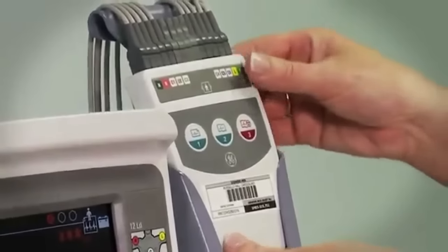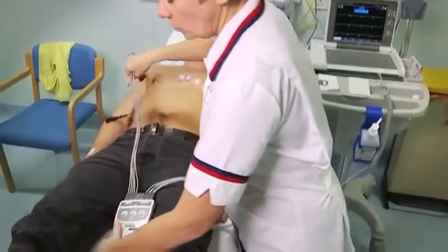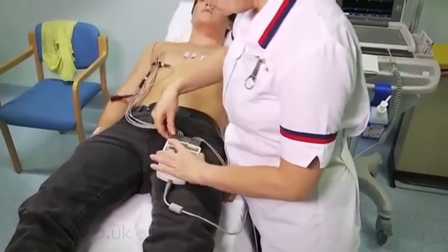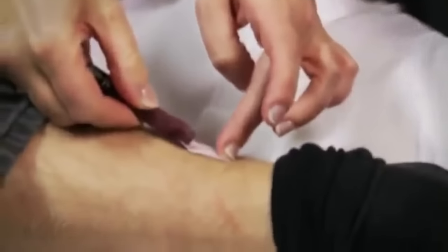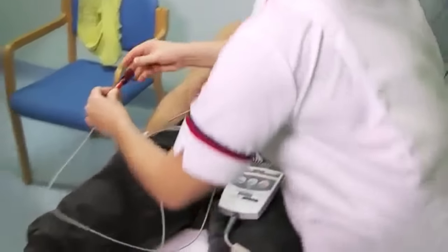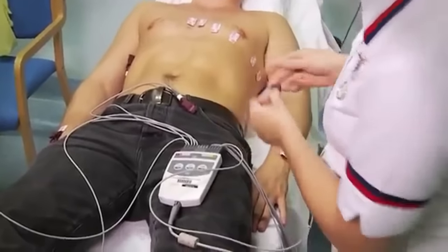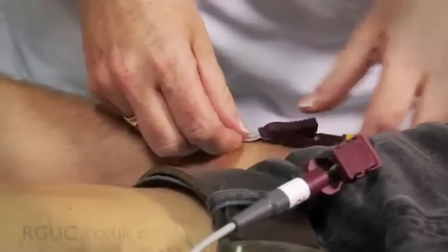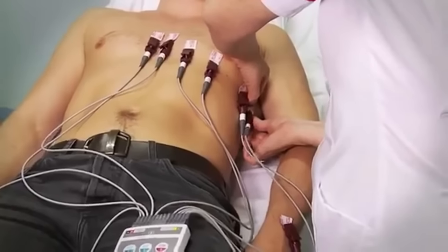Once the electrodes are in place, connect the lead clips to them. Ensure that the leads are correctly connected to the corresponding electrode tabs — the leads are clearly labelled to enable this. Attach the limb leads as follows: on the right lower leg, place the black lead; on the left lower leg, place the green lead; on the right forearm, place the red lead; and on the left forearm, place the yellow lead. Now move on to attach the chest leads to the corresponding electrodes, C1 to C6, from the patient's right to left.